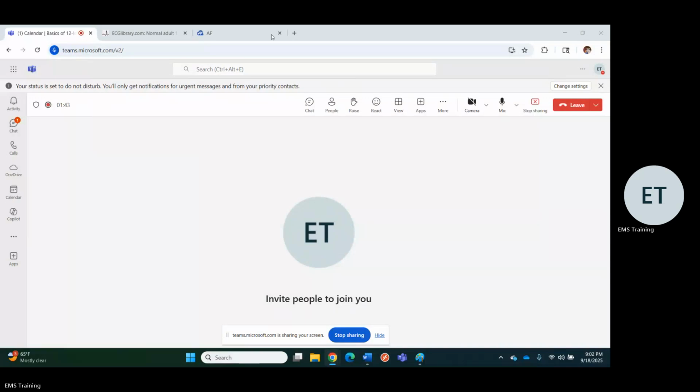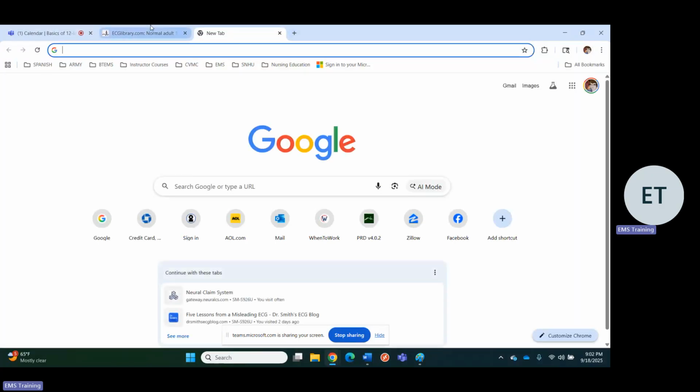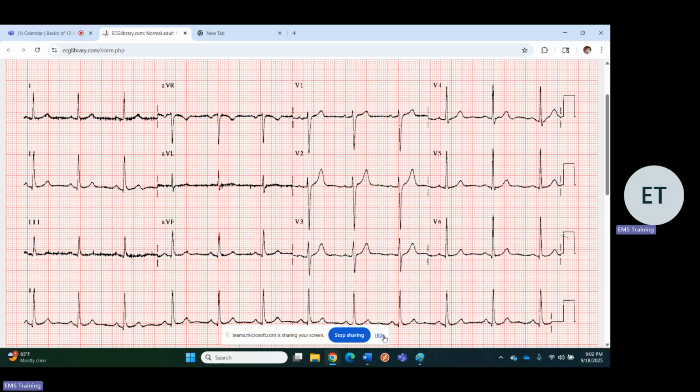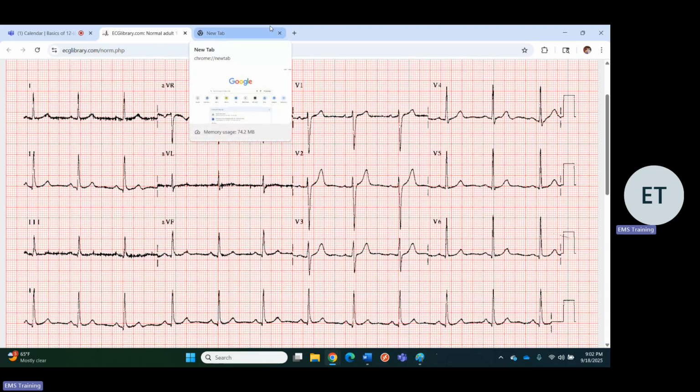So now that I've done the first 2 videos, I have a better idea of where we started and where we are now. I won't review it like I did in the last one because it took me a half hour both times, but I'm going to say what's important to memorize. Memorize a normal EKG. Memorize a 12 lead. Get intimately familiar with what a normal one looks like so that even if you don't know how to define it, you can say that your 12 lead currently is abnormal.